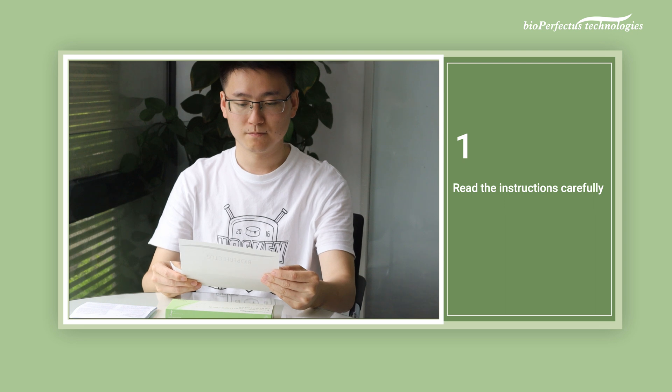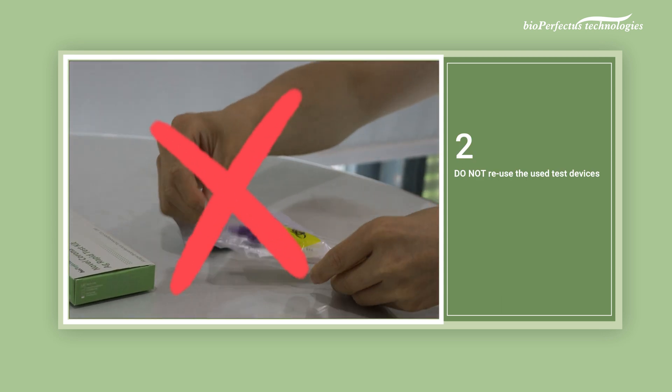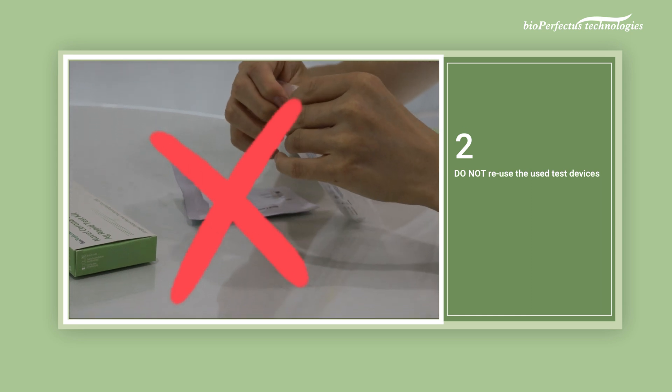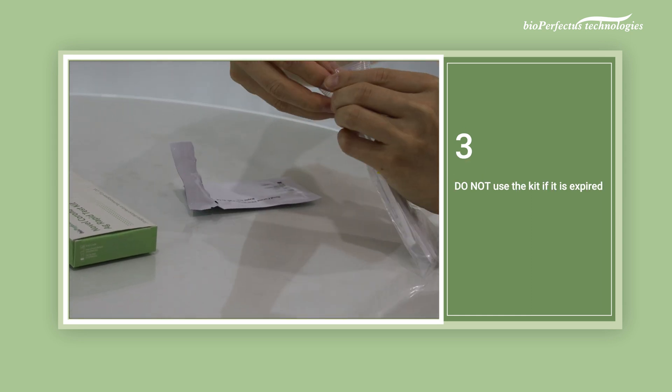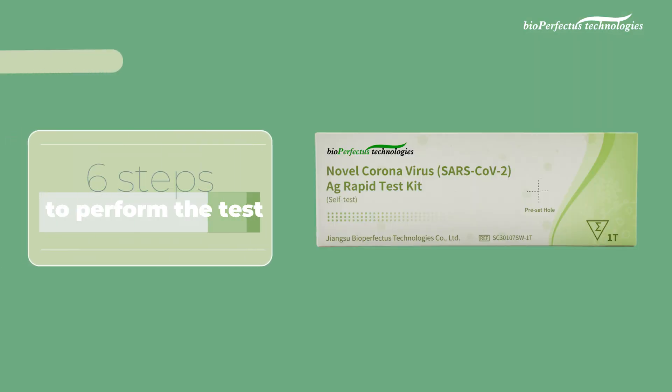There are some precautions you need to notice before you start to perform the test. First, to obtain correct results, read the instructions carefully before starting the procedure. Second, all test pieces are single-use items. Do not reuse the used test devices, tubes, or swabs. Third, check the expiration date carefully, do not use the kit if it is expired. Six steps to perform the test.